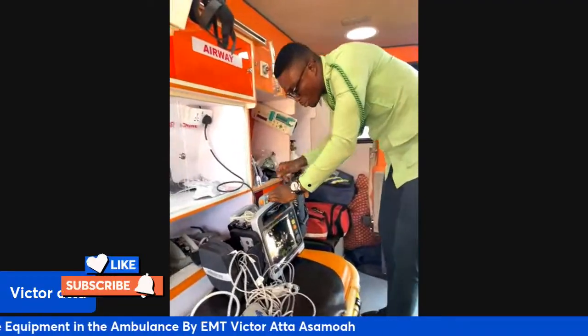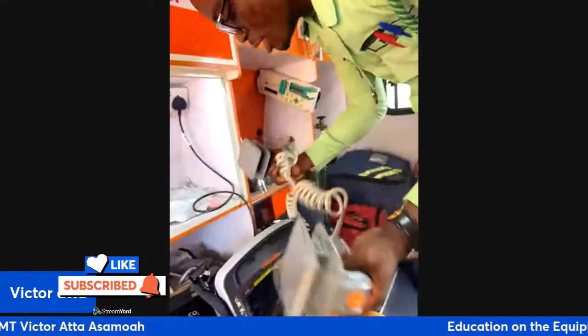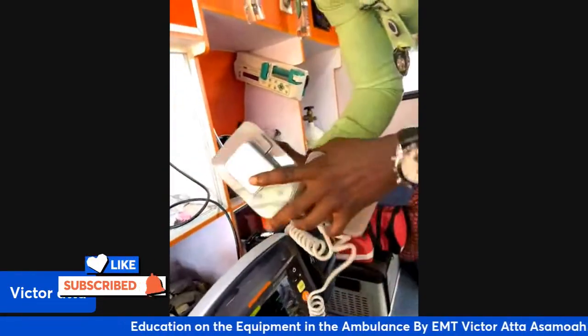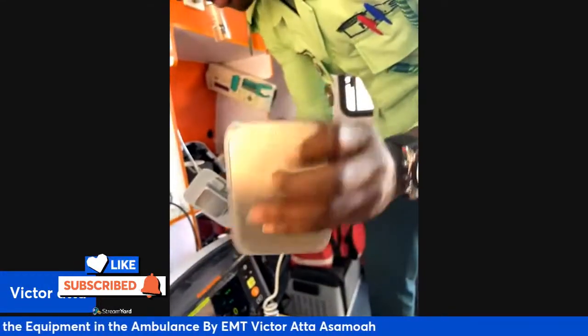So we have the second part, we have the adult and then the pediatric. So this is the adult part. When you press here, this one is for pedics, and then these ones are for the adults.